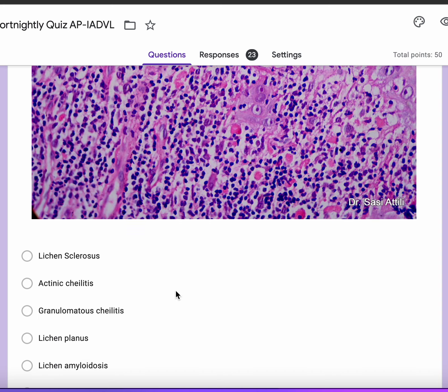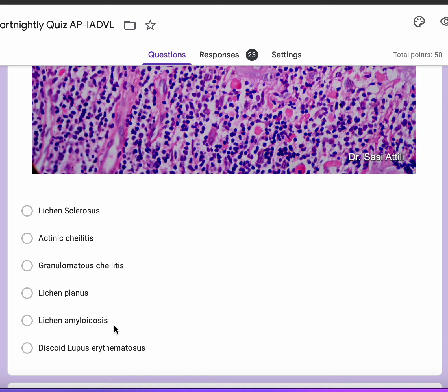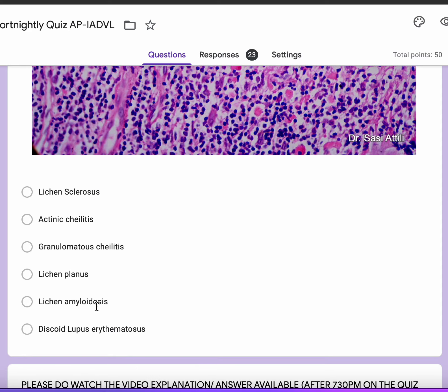The differentials given are: lichen sclerosis, which usually presents with papillary dermal sclerosis and below that a band of lichenoid infiltrate, which is absent here. Actinic chelitis is a premalignant condition — you should be able to see epidermal dysplasia, which is absent here. Granulomatous chelitis is a granulomatous entity — there's no granuloma here. Lichen amyloidosis is very unusual and rare on the lip, and this is not amyloid — this is just extensive colloid body formation.